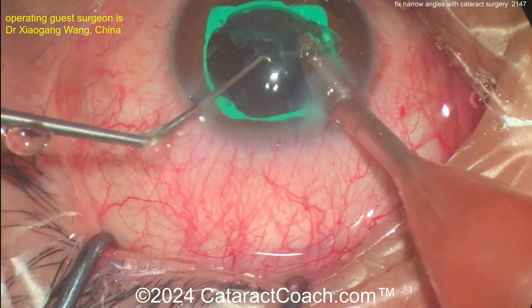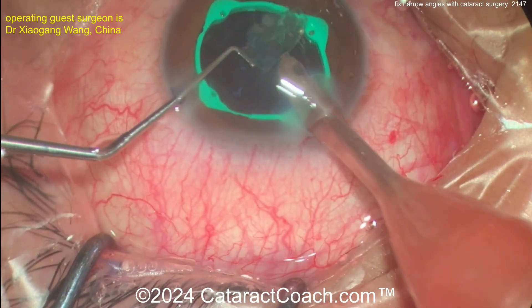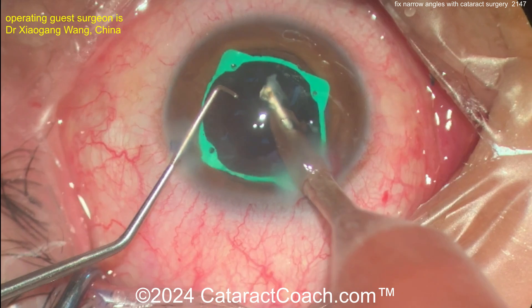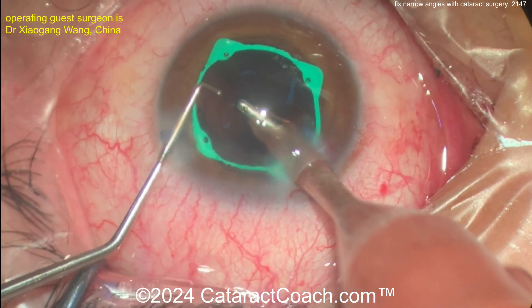Time to switch over to the I/A probe and clean up the cortex. Not the hottest red reflex on the side — wonder if that's the microscope lighting. Clean up all that lens material, very nicely done.